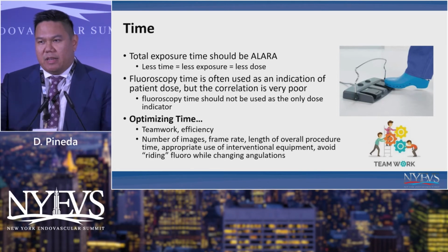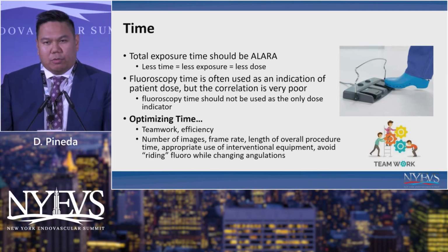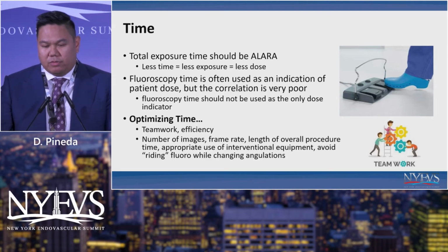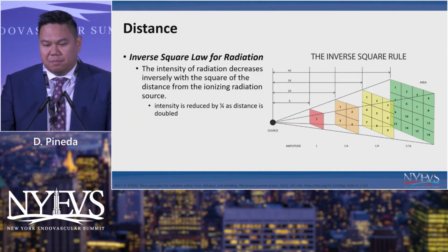To minimize fluoroscopy time, one of the most important things, especially for the nurses and techs here, is working efficiently, anticipating the next step. The longer we struggle, the longer we try before you get the next equipment, the more fluoroscopy time, the more dose. So teamwork, I think, is very important to maintain ALARA.